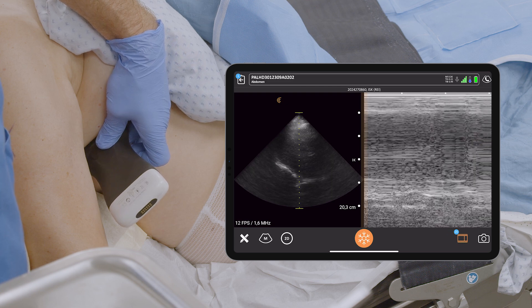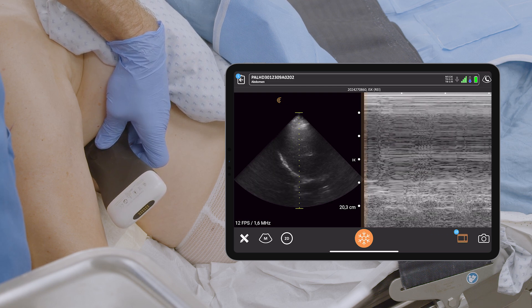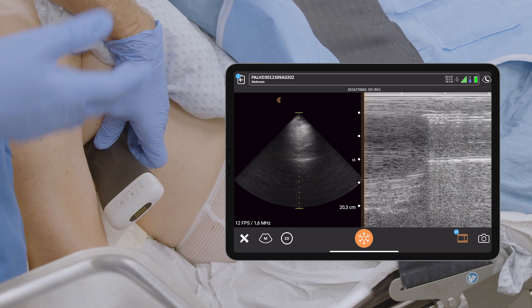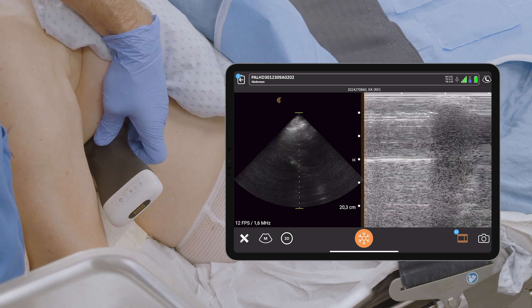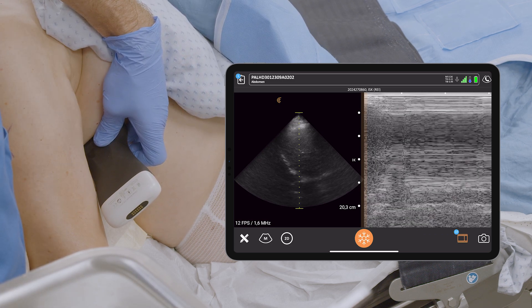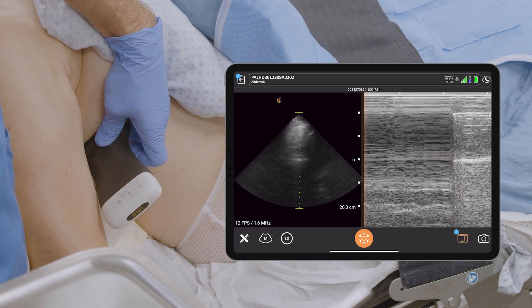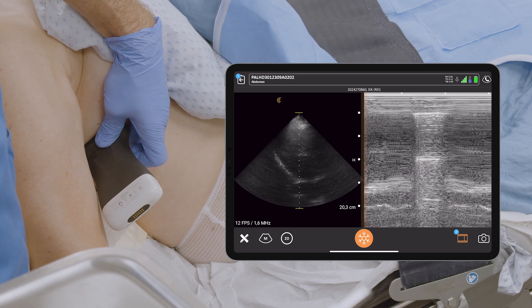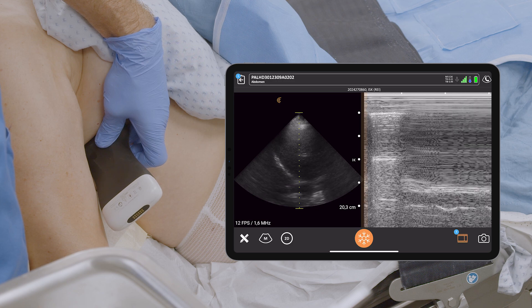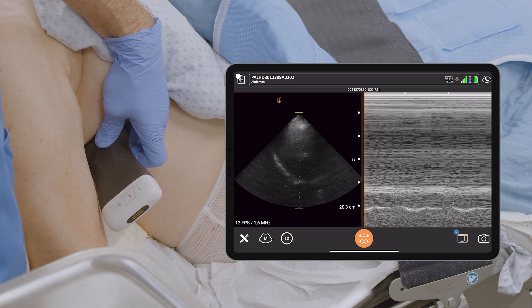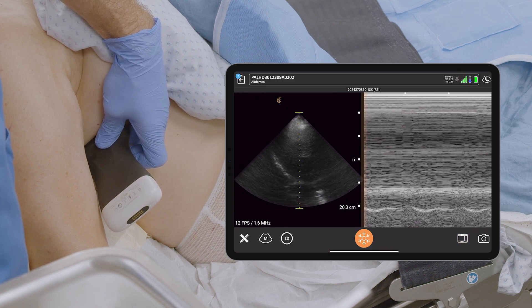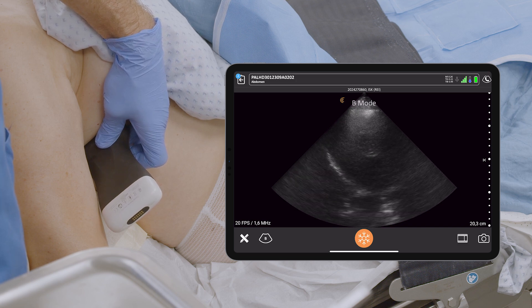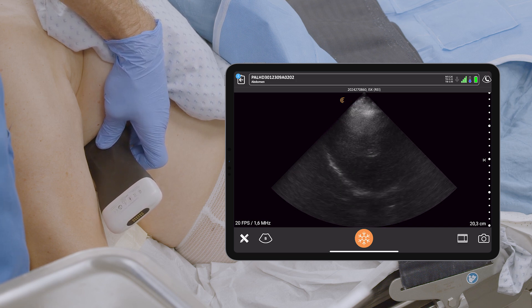I ask the patient to sniff quickly, as if a drop were hanging under their nose — quickly and repeatedly. This is the sniff test and everything is normal. 'Capture video' will stop the recording. 'B-mode' will go back into normal B-mode. We have a totally normal diaphragmatic function.